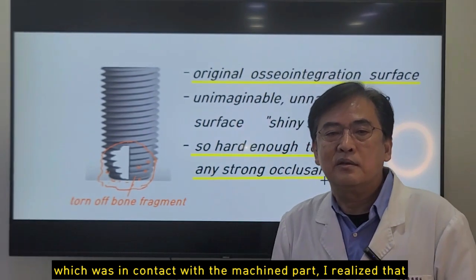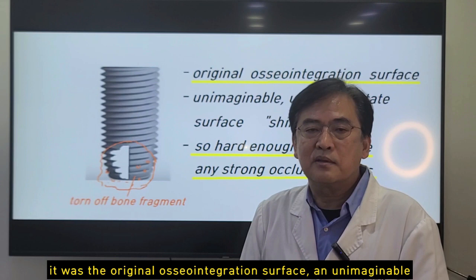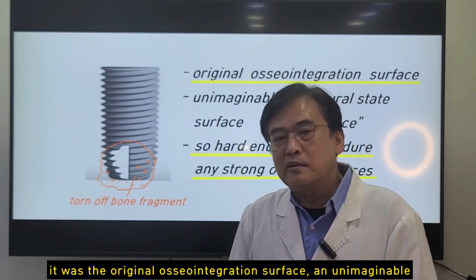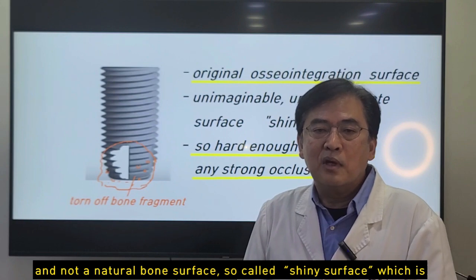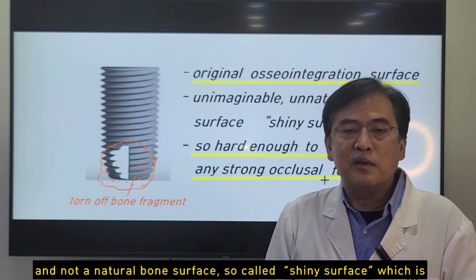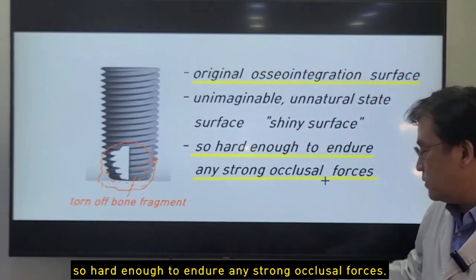I realized it was the original osseointegration surface, unimaginable and not a natural bone surface, a so-called shiny surface, which is hard enough to endure any strong occlusal forces.